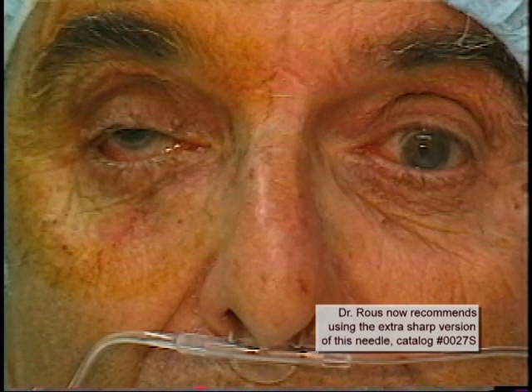Now we are in the OR, about 10 minutes later. The patient is brought back from the holding area to the OR very quickly. The Honan's balloon has been removed and additional digital massage done. The instruments at this point are just about ready to be taken from the autoclave, so there is no actual delay in getting the next case started when you are using only one room.